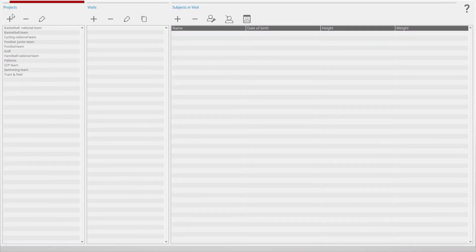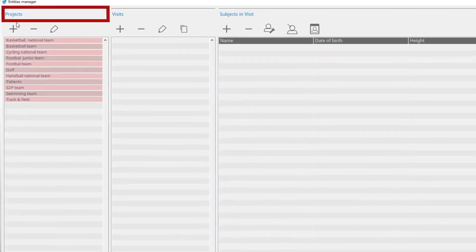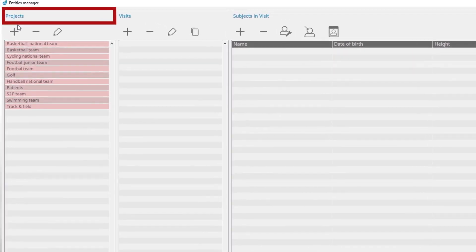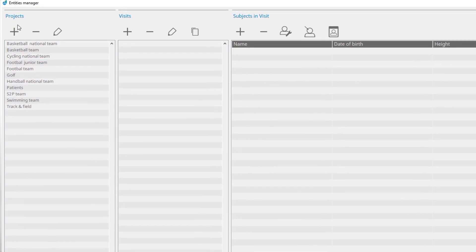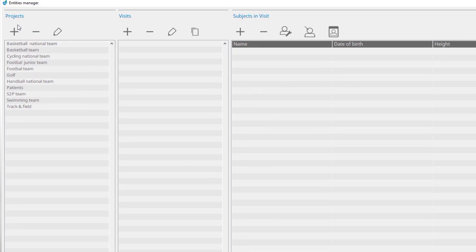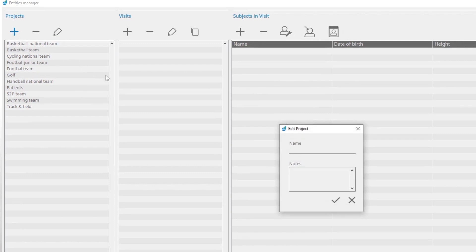The Project panel contains a list of already existing projects. Above the list, you can see buttons to create new projects and to edit and delete existing projects. With the Add button, you can create a new project.